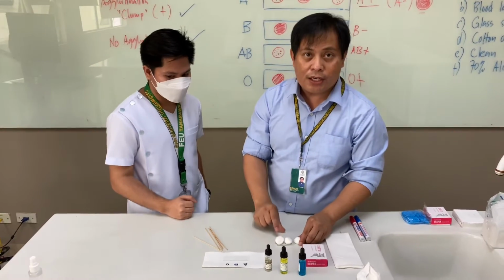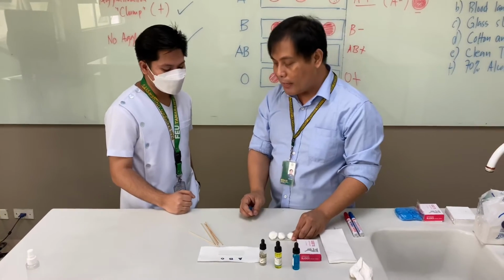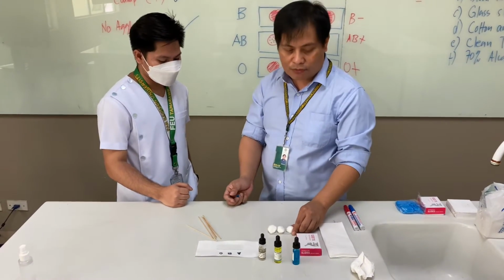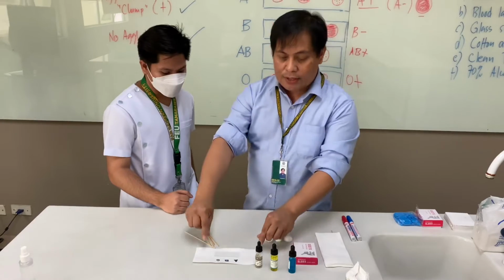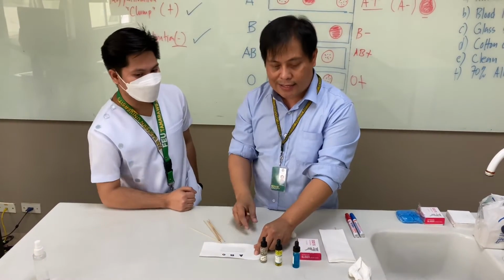I have here the cotton, which is used to apply aseptic technique to the fingertips of Von. And I have here the tissue, where I place the glass slide.